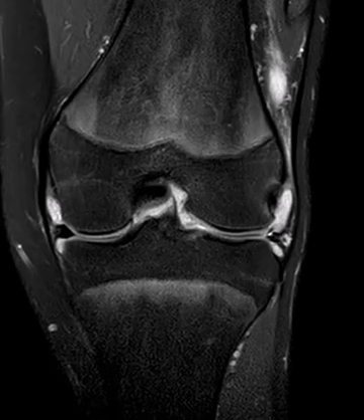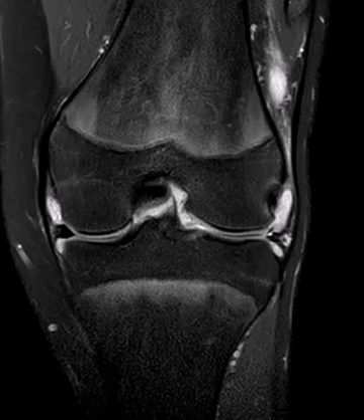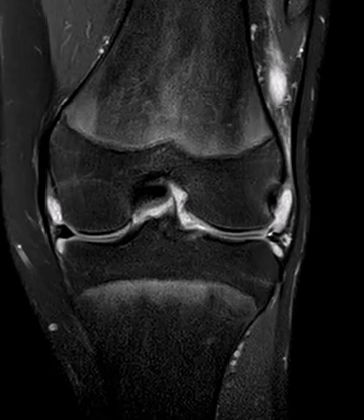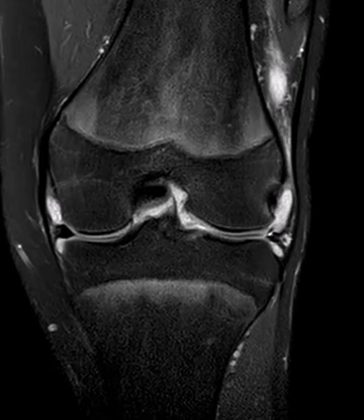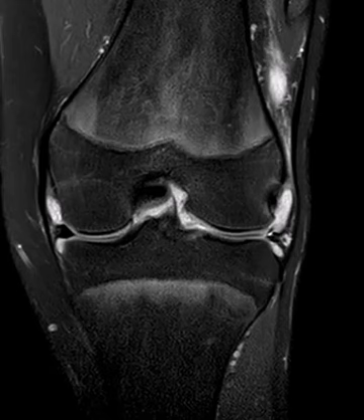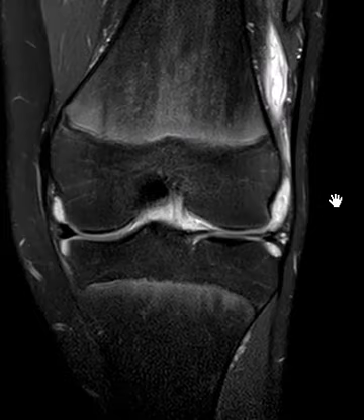Hello, this is Dr. Gay from First Lake MRI. This is a 15-year-old male who had knee pain and swelling for one to two weeks and was brought in for an MRI scan.